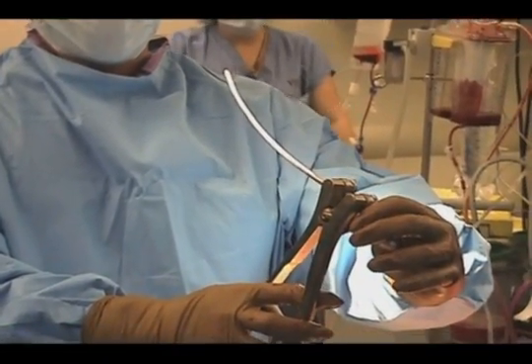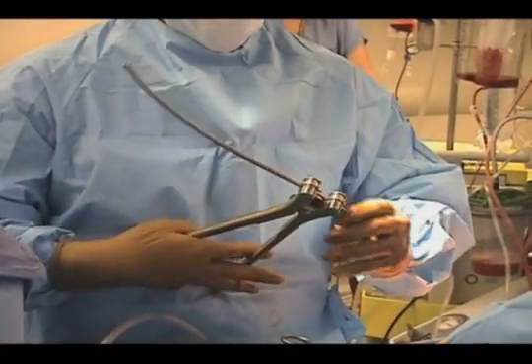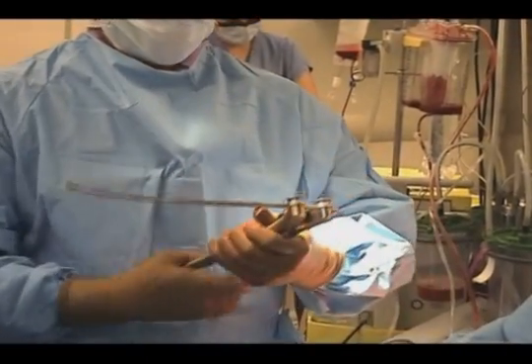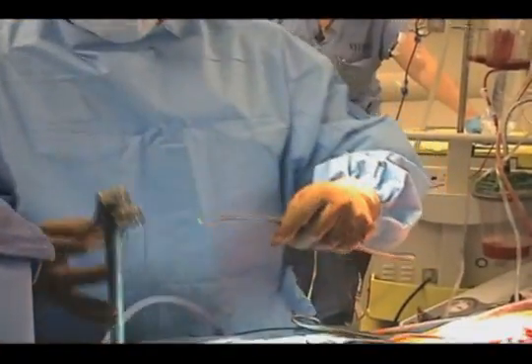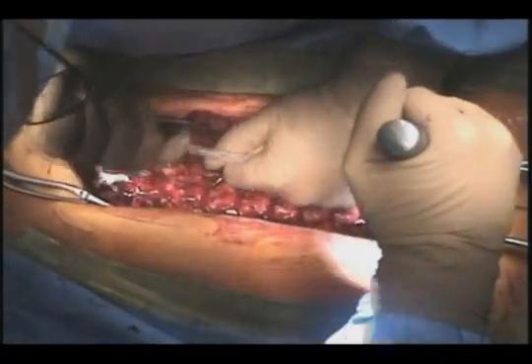And I sight down the rod to ensure that I do not induce scoliosis into this. I want the rod to be perfectly straight in the coronal plane, and I again enhance kyphosis and put some lordosis in this. And that's really done on an individual basis for the patient and their innate anatomy.